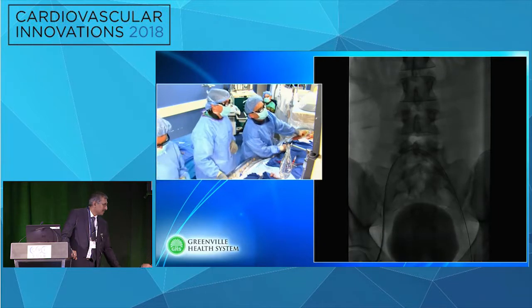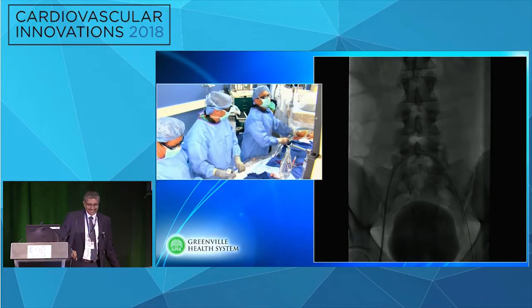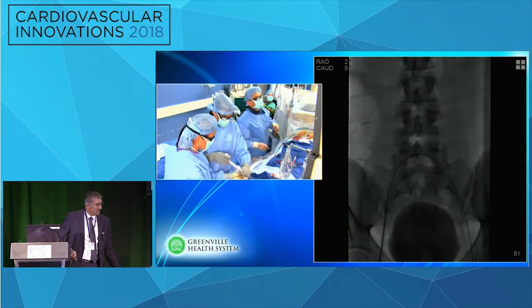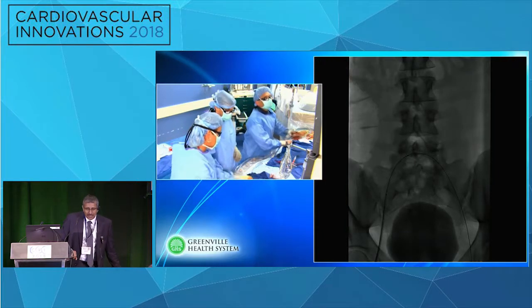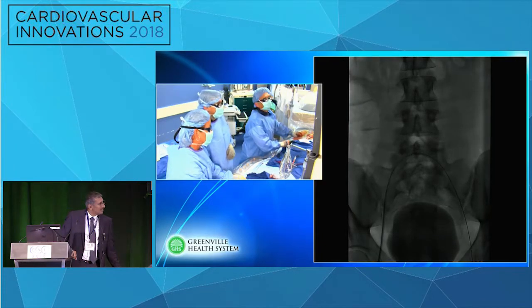Let's see if we want this 12 balloon out. That was with a 12. Pull the balloon, leave the wire. Not fully deflated, re-burp it. Okay, it looks like 10 or 12 minutes to get this stented, right? Yes. So I'm thinking a 12 or 14 down first. What do you guys think?